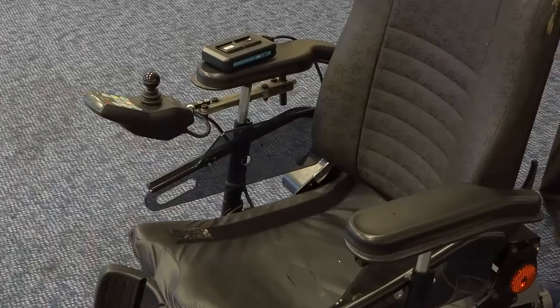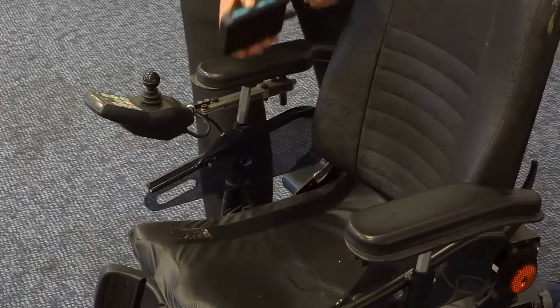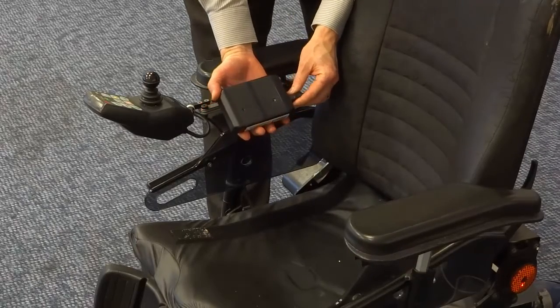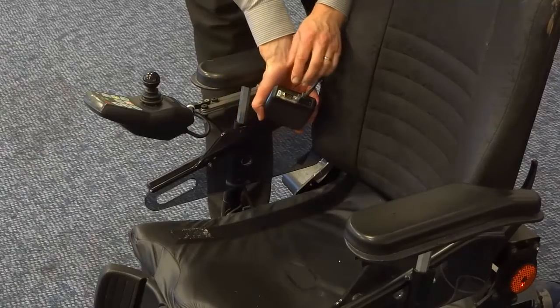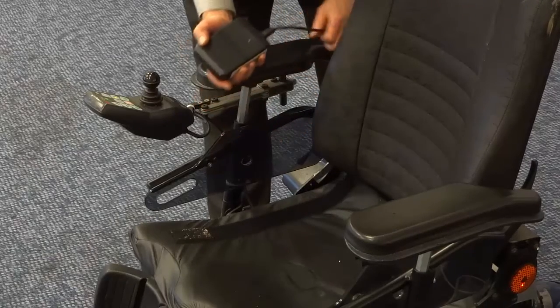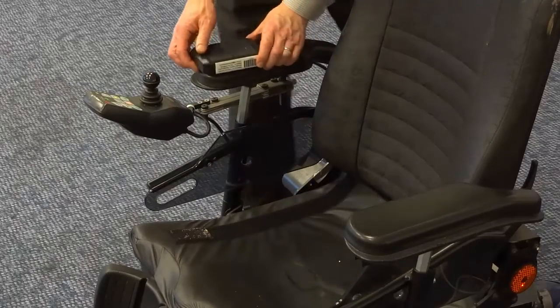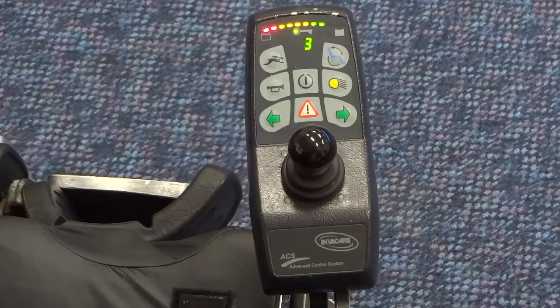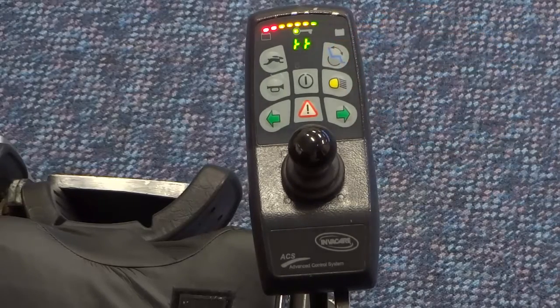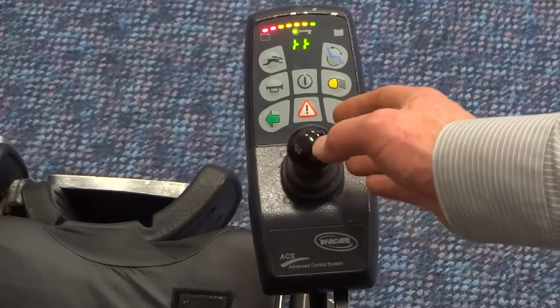The DX ECU is an optional module for power wheelchairs that have DX Dynamic Controls. It provides a way to control external devices to the power wheelchair, typically a communication machine, environmental control unit, or a computer. These can be controlled by the wheelchair user's input device, such as their joystick. The DX is connected to the wheelchair's DX bus and normally put out of view underneath the seat.